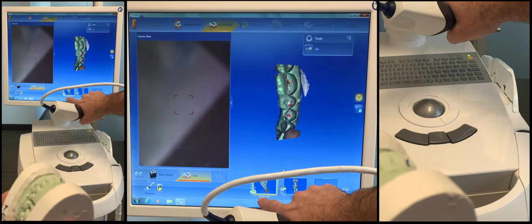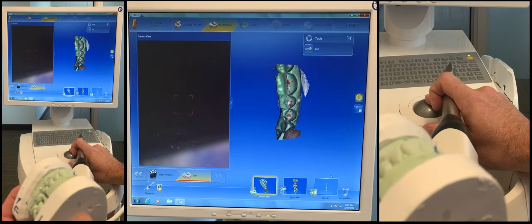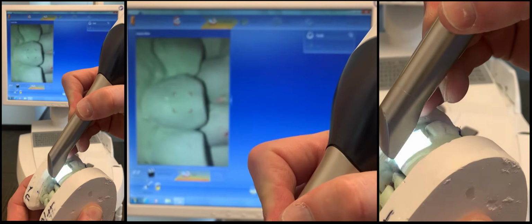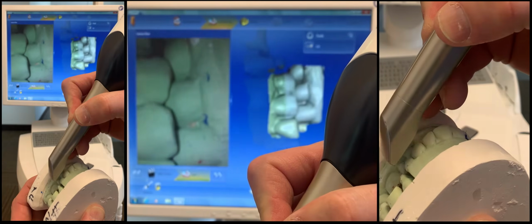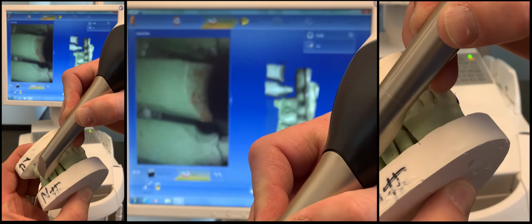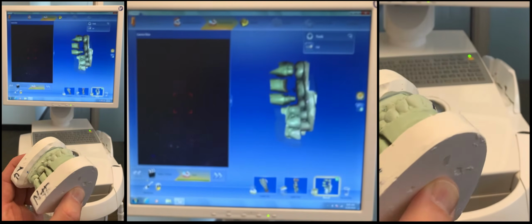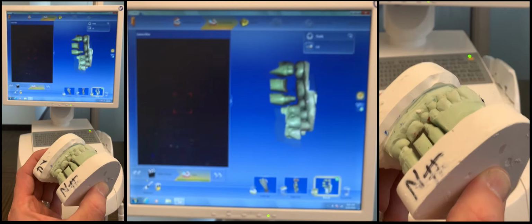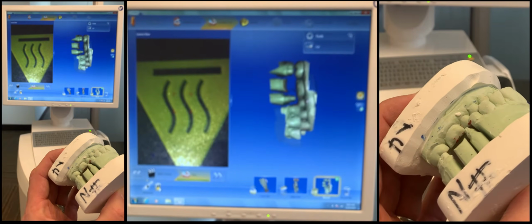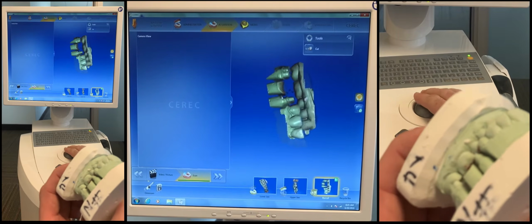Oh, see, it's not collecting it because I'm still on the lower jaw here. So I need to activate the buccal folder, and now we're going to go ahead and scan that. And then all you really need to do is walk up and down a little bit along that buccal side of those teeth, and that's plenty of data right there. Okay? So at this point, let's turn that camera off and kind of evaluate what we have. There's plenty of data here.